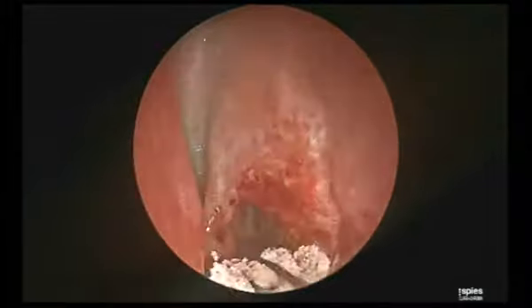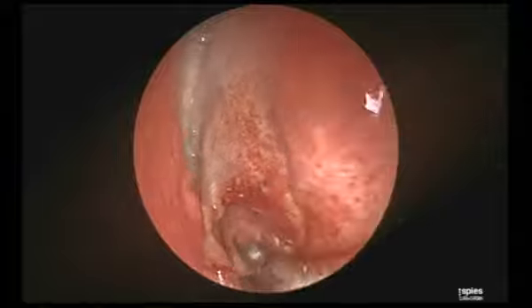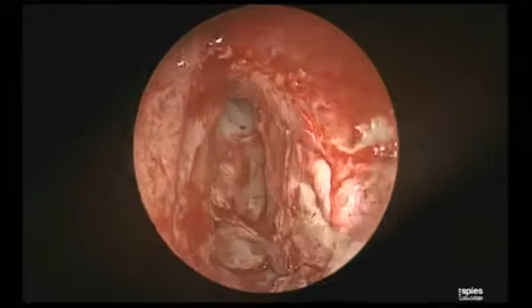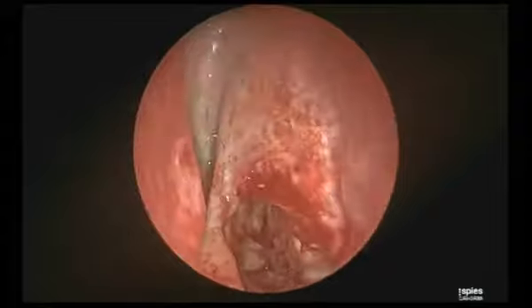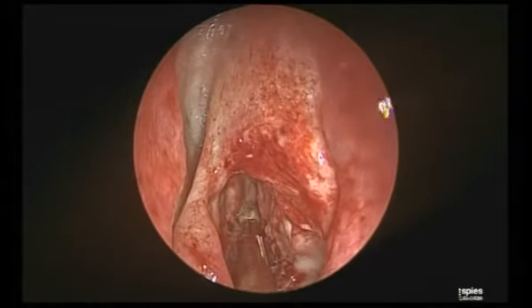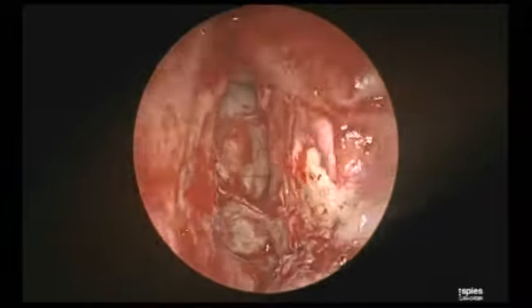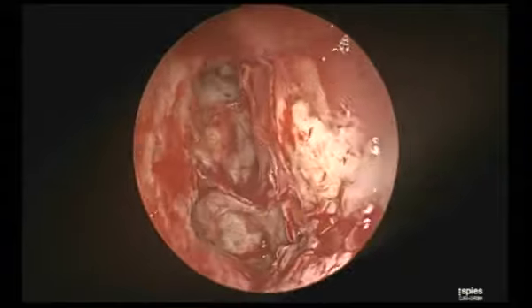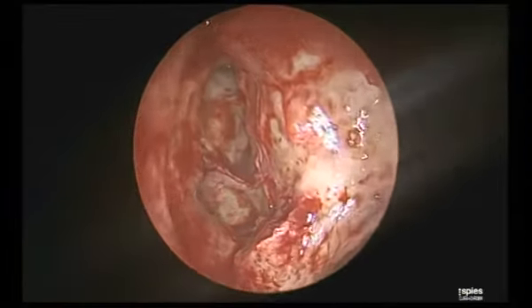So what you did just now with that 40 reverse, is it kind of mandatory or obliged to do that much of a finishing? Yeah, I need to do that because of my irrigation. Irrigation we are going to discuss later. The role of sinus surgery is now more and more to go beyond ventilation into irrigation. So I need to give full access to the irrigation. If I leave some septa, my irrigation may not reach the supraorbital cell or something.